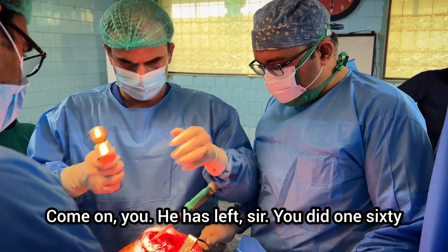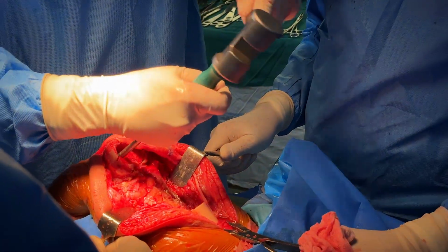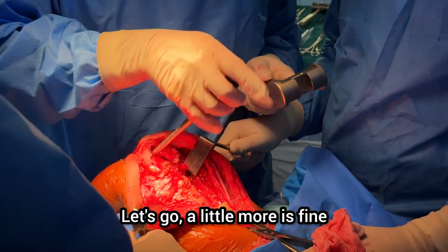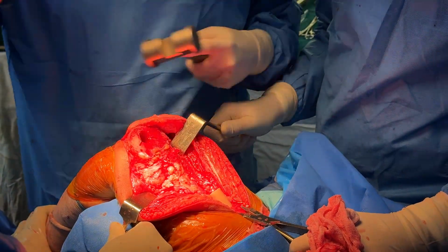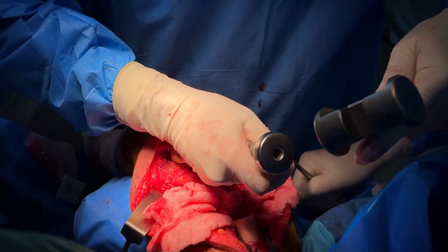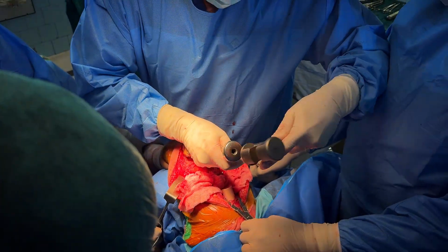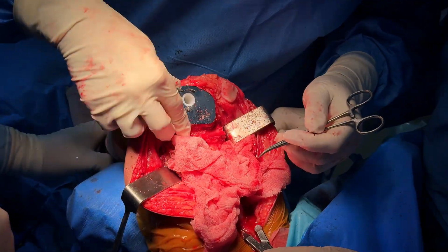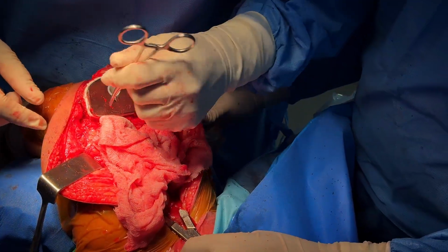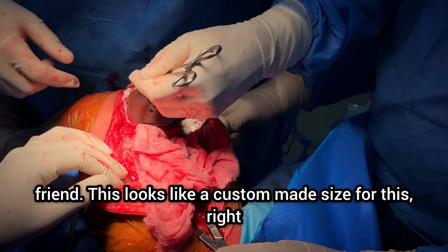160 के लिए... ये लंबा है ज़रा. 70 का होगा ना. चलो थोड़ा ज़्यादा ही ठीक है. आ जाए भाई. तो ठीक है, अभी काफ़ी ज़्यादा कवरेज है और डीप है. बहुत अच्छा है. क्या साइज है यार, ये लगता है कस्टम मेड साइज है इसके लिए ना.